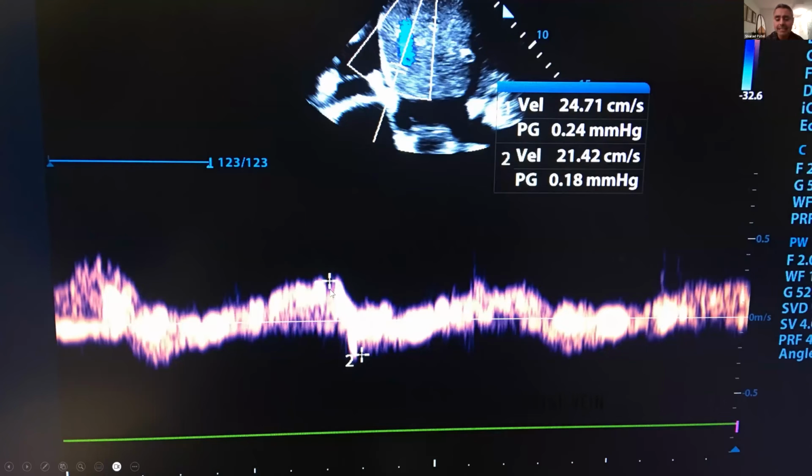So again, you see this biphasic picture. What it should look like is completely flat. And so this is markedly abnormal. And you can see the IVC up here as well. You see this dilated IVC here. And if I were to measure this, and I know I have measured it, when I'm getting to this step, I've already measured the IVC. And this IVC, just eyeballing it, is 100% greater than 2 centimeters, and probably much less variation as well.